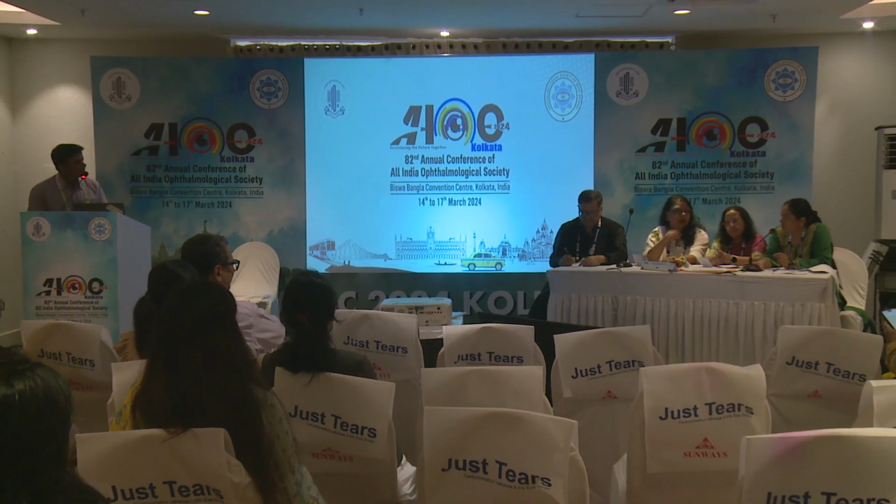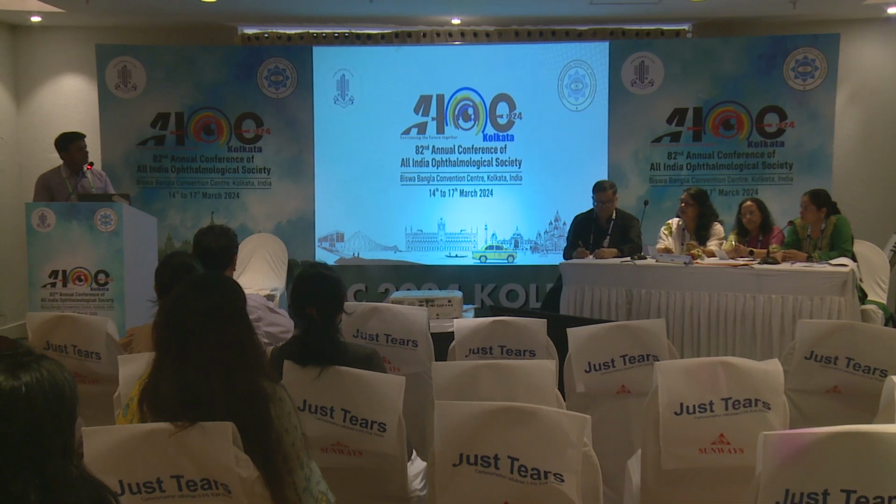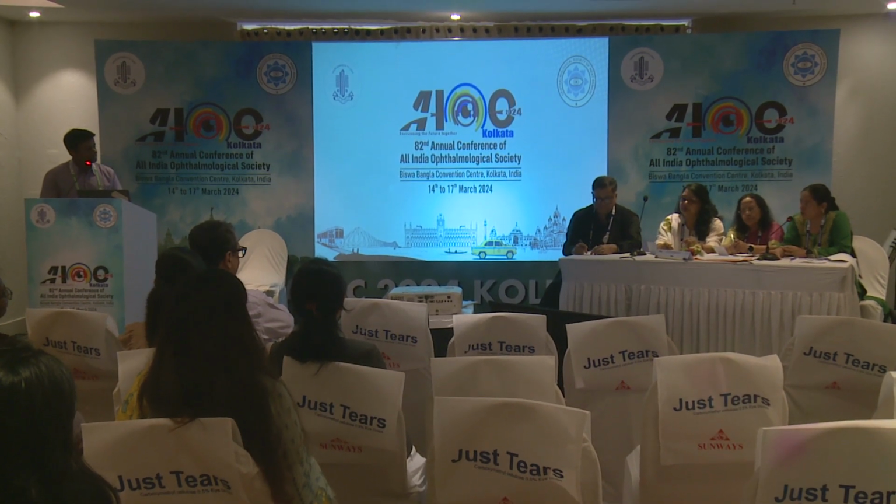What is the exact dimension by which you actually shifted for temporal capsular excess? Ma'am, around 1 millimeter, ma'am. 1 millimeter. Yes, ma'am.